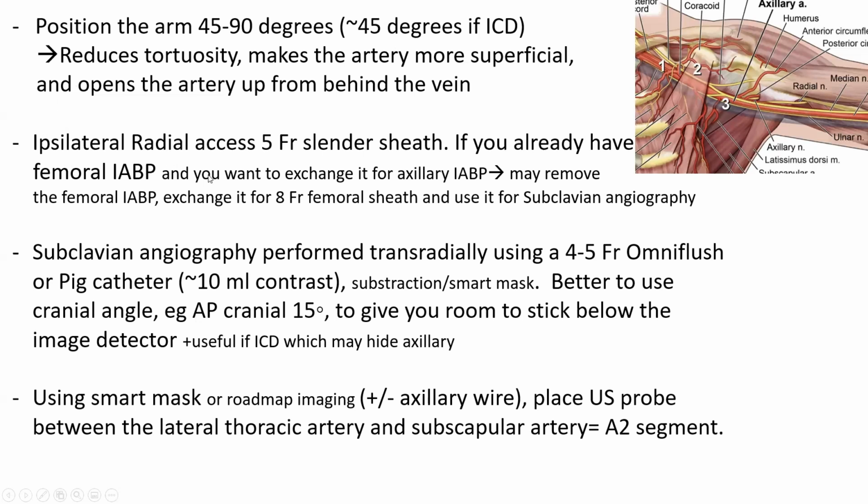We prep also the ipsilateral radial artery, and we do ipsilateral radial access with a 5 French slender sheath. If you already have a femoral balloon pump that you want to exchange for an axillary balloon pump, in that case, you don't need to do a radial access. You may remove the femoral balloon pump, exchange it for an 8 French femoral sheath, and use that for subclavian angiographic guidance. I will explain it a little more later on.